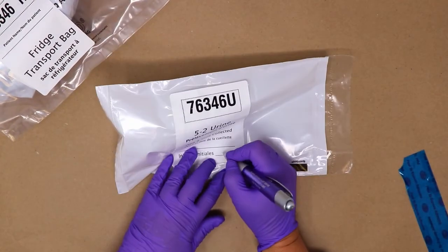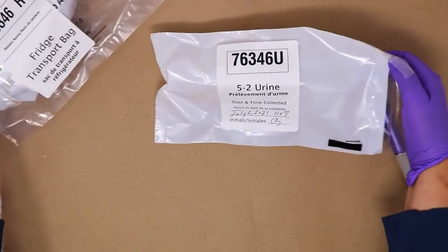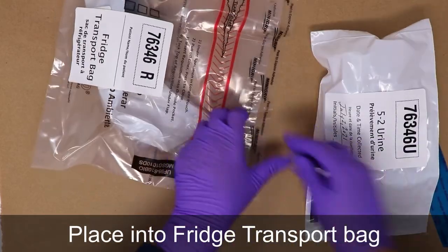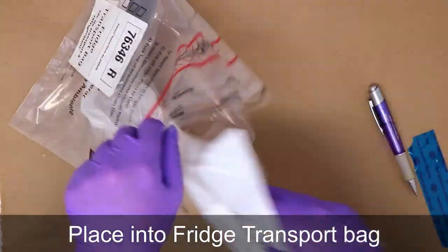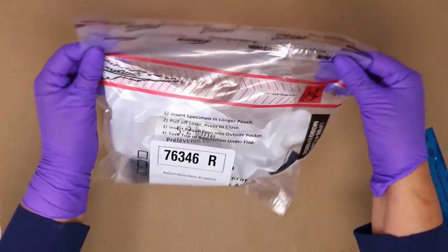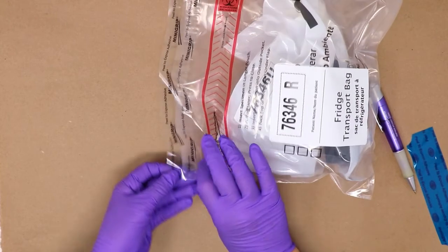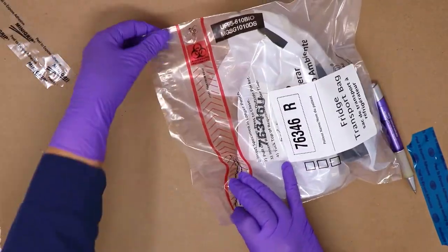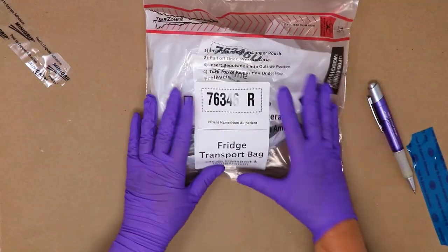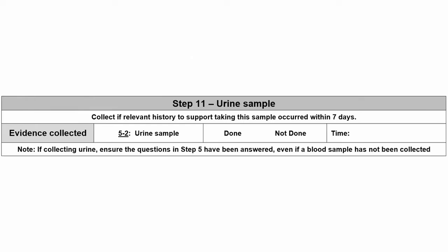The label should then be completed. This urine bag may then be placed into the fridge transport bag along with the blood sample 5-1, and the fridge transport bag sealed. And a patient's name added to the outside. The paperwork for step 11 can then be completed. Here, circling done for 5-2 urine sample and including the time of collection.